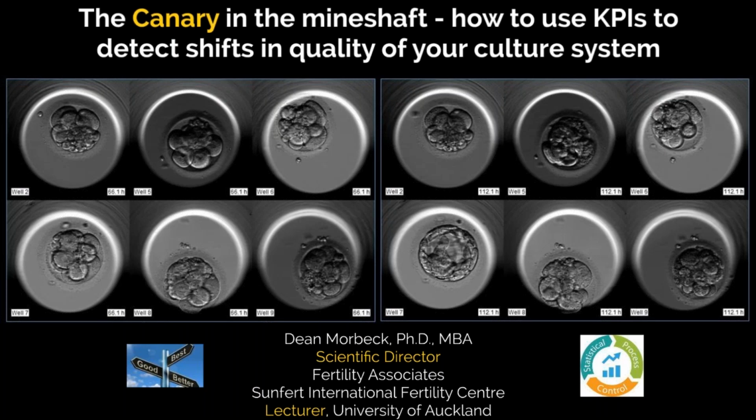Okay, let's do one more question. Together with visualization of the data points, do you run statistical tests to identify significance of the shifts? The point of the control chart tracking is that you already have the statistics built into the chart. We don't do any other statistical tests while we're tracking because we have our standard deviation list and the whole Westgard rules around tracking the performance of a system does not require any other statistical test to be run. Now, there's more to be run to confirm that something is definitely impacting it. But on a monitoring basis, no, that's the whole point of having the chart.